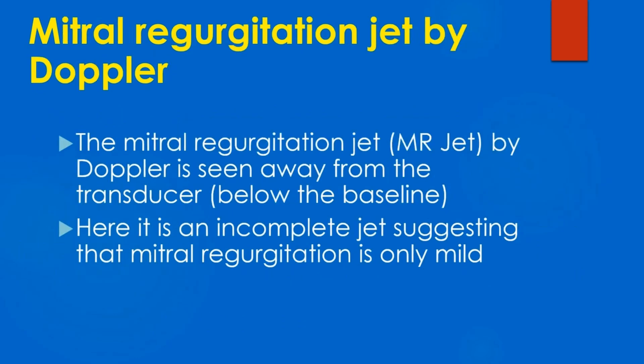The mitral regurgitation jet by Doppler is seen away from the transducer, below the baseline. It is an incomplete jet in this case, suggesting that mitral regurgitation is only mild.